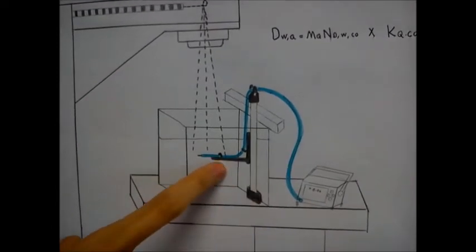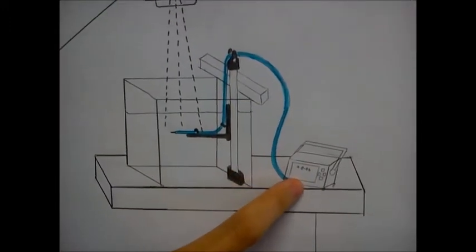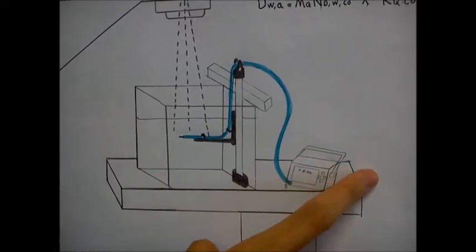The ionization chamber is connected to the electrometer. The electrometer is a device for measuring small currents, and the electrometer is then connected to a power supply.